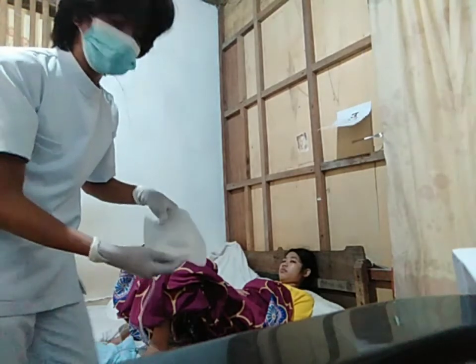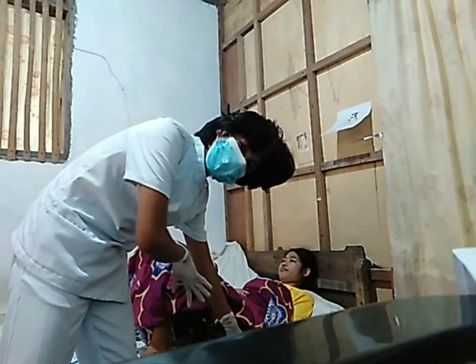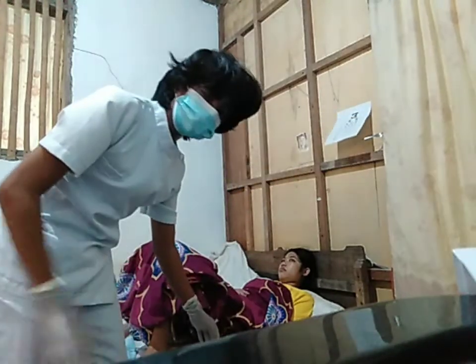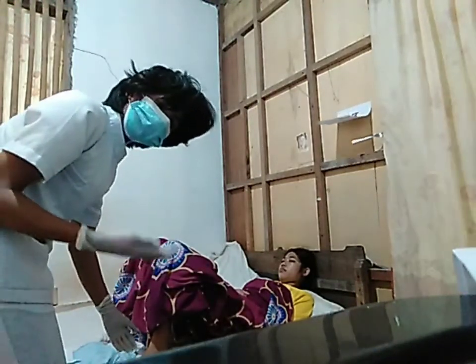So we will now place, assuming that this is our urinary bag or collection bag, beside the patient on his bed. We will just hang it there, and make sure that the bag won't move so that the urine of the patient won't leak. So okay, after that, position the patient in a comfortable position.